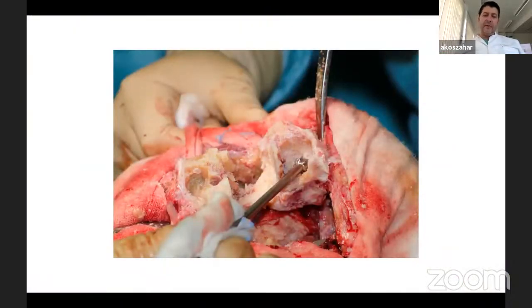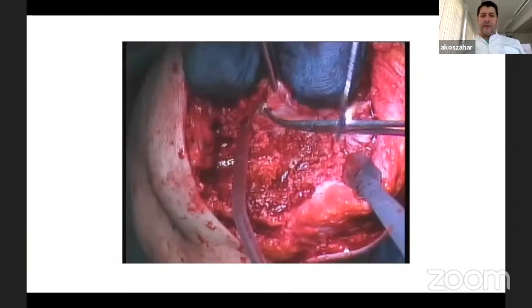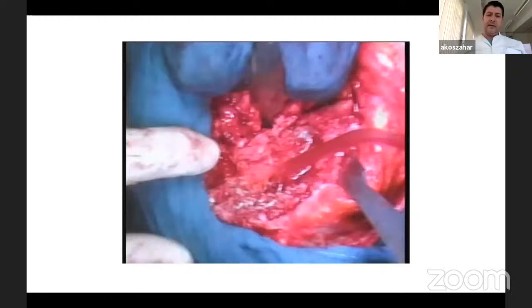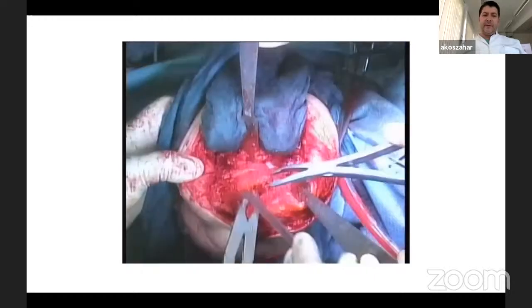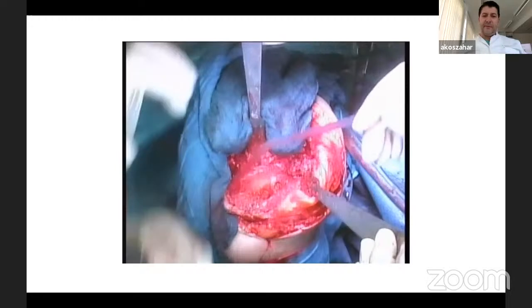Then you debride the bone after removing all the hardware, all the cement. You debride the bone and you clean up the surface. Of course, in the knee, you have to debride the posterior aspect of the knee as well, which is a little bit dangerous, but it's important to debride the posterior capsule and the bone, the proximal tibia, the distal femur.